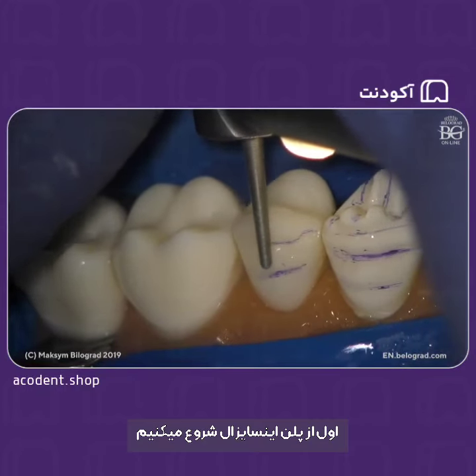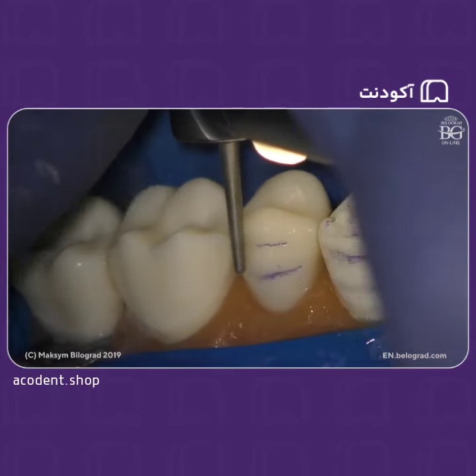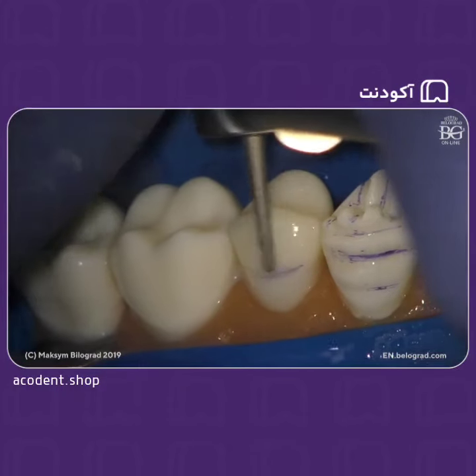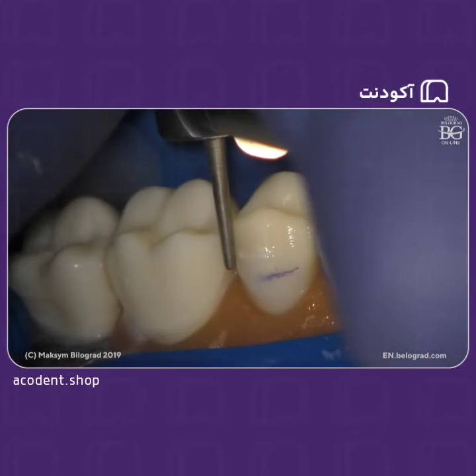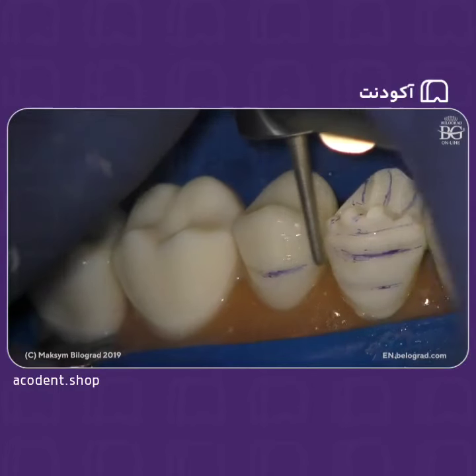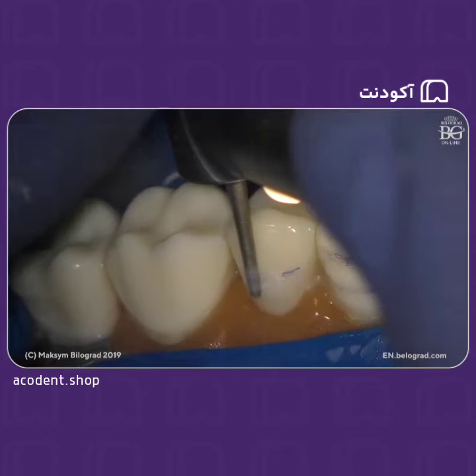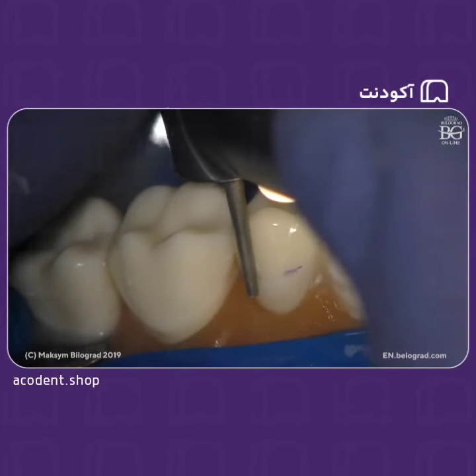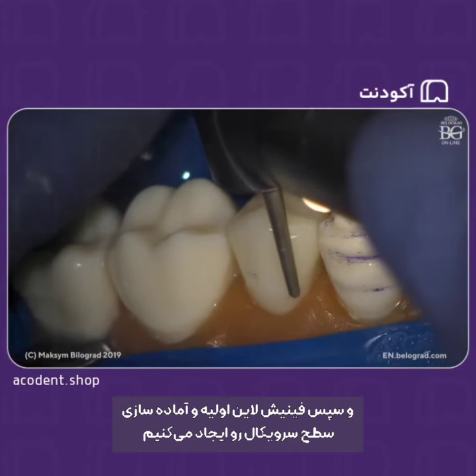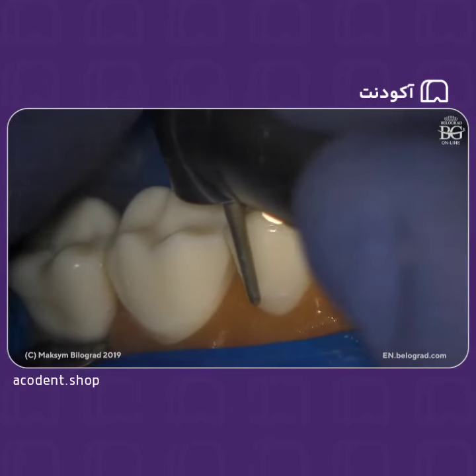This will be the incisal plane, let's say. That will be the middle plane. And there will be the initial finish line and cervical preparation.